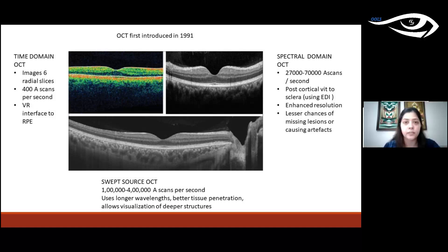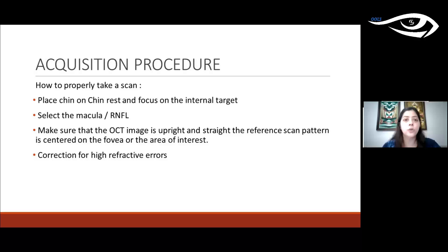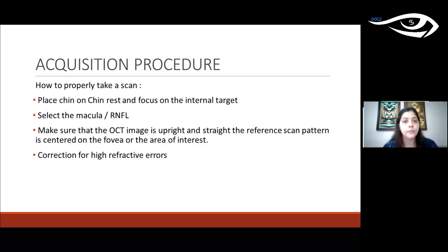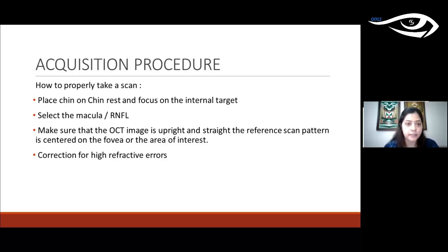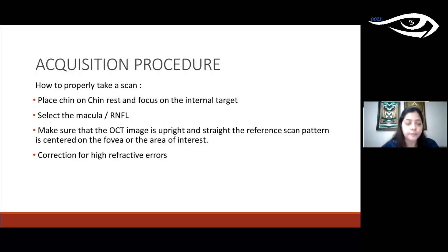To take an OCT correctly, ask the patient to place the chin on the chin rest and focus on the internal target. Choose the appropriate program — macular or RNFL. Ensure the OCT image is upright and straight, and the scan pattern is centered either on the fovea or the area of interest. Some machines also allow you to correct for higher refractive errors.